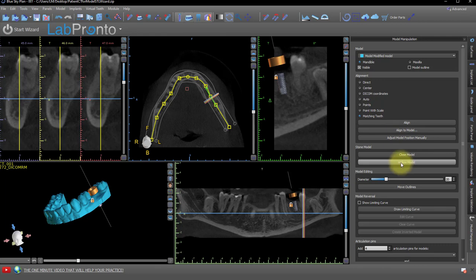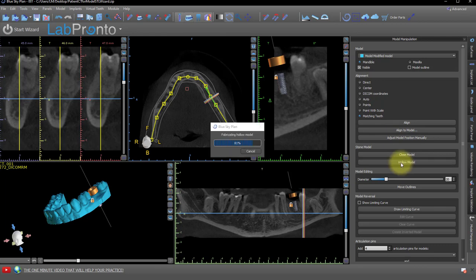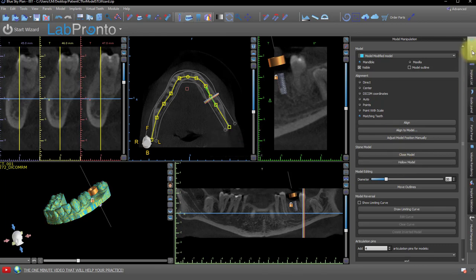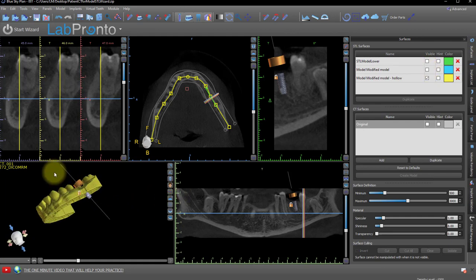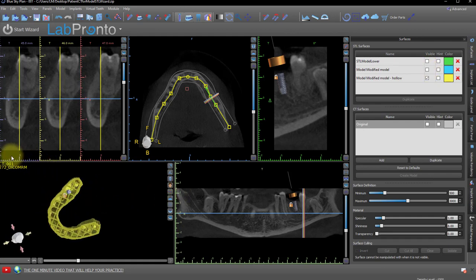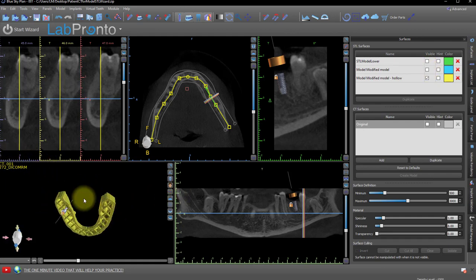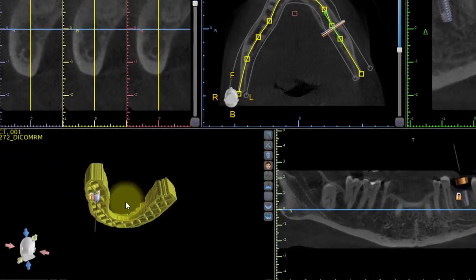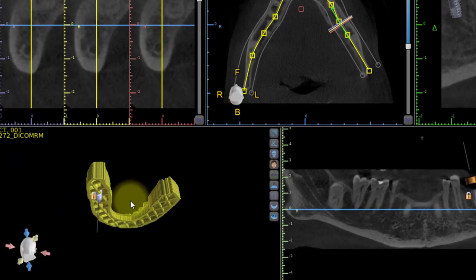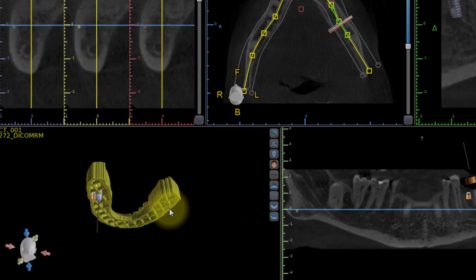Now click Hollow Model. Go back up to the Surfaces panel to hide the original model. If we turn the model over and look, we'll see that it is hollowed with just support bars going across the bottom.